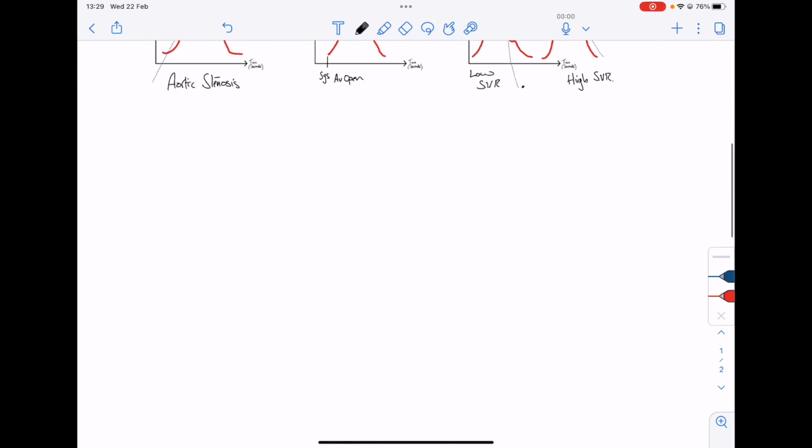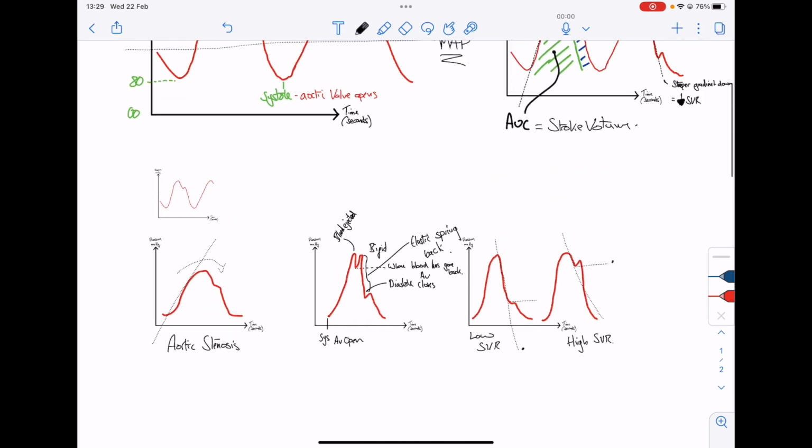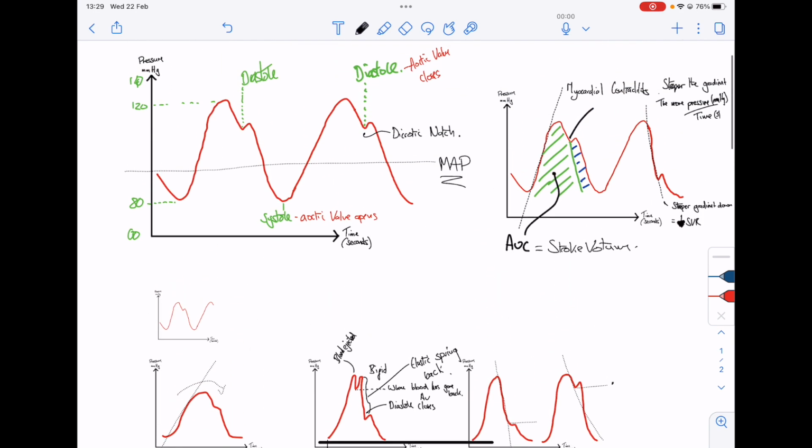They might then subsequently ask you about pulse contour analysis, so PiCCO, LiDCO, all that sort of madness, whereby it does some clever fancy stuff to work out the area under the curve by breaking down this bit into some sort of sinusoidal wave pattern. I'll go over it in a different podcast, vodcast, whatever you might want to call it, and perhaps we can talk about that in a bit more detail.